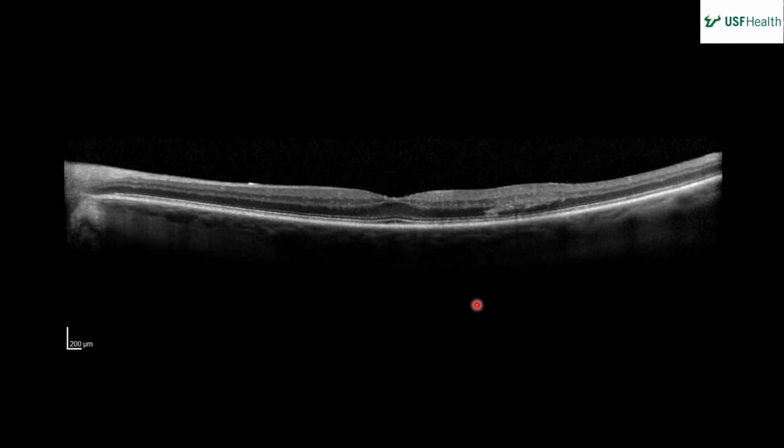Okay, so OCT of the left eye. The center looks good, no fluid or disruption of the layers, still good foveal contour. But then attention's drawn to the middle layers, probably the deep capillary plexus. You see some disruption of the inner nuclear layer that extends maybe a little bit to the outer nuclear layer, but looks to be contained in the deep plexus. So actually, that area, that's all outer nuclear. Oh, it's all outer nuclear. And it's interesting, capillaries are not there. The outer nuclear doesn't have them.